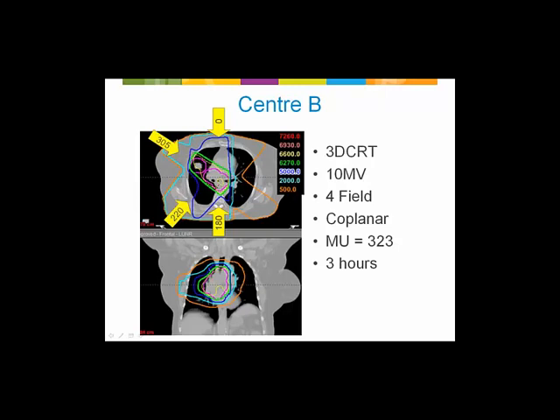So if we take these, there are some interesting characteristics and similarities between them. Let's take a look at the 5 Gray line, for instance. This is really defined by how we angle our beams and what angles we allow for treatment. And if I scroll through plans, you see that it's actually quite similar, especially in terms of how we provide some sparing of the contralateral lung. So that was interesting.